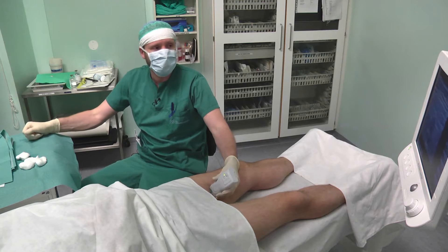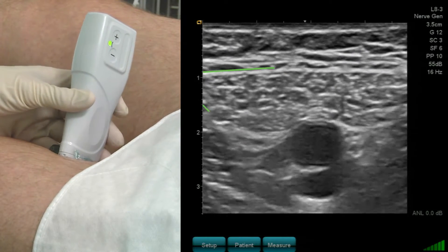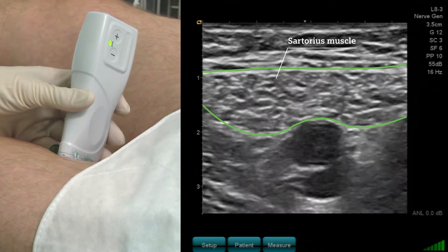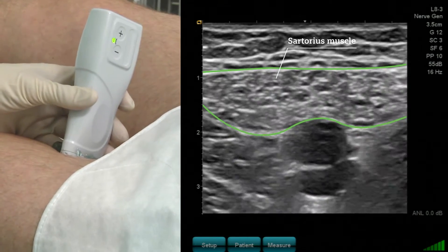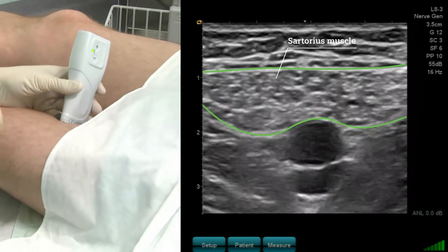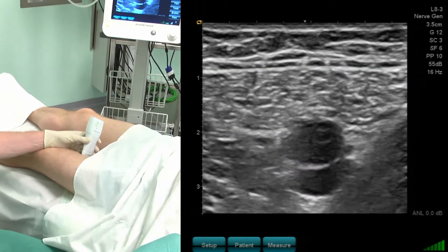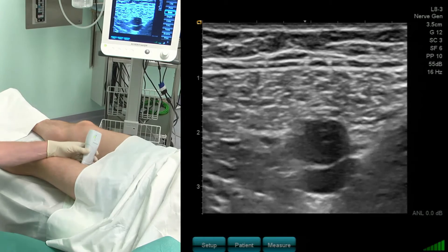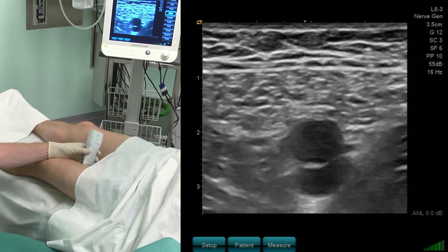I now want to identify the sartorius muscle. This is seen right above the two vessels. The sartorius muscle goes in an oblique direction from the anterior superior iliac spine to the medial epicondylus. Below the sartorius muscle we see two vessels — on top is the femoral artery and below is the vein.